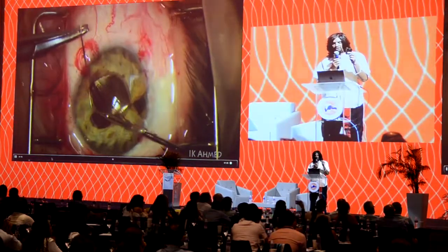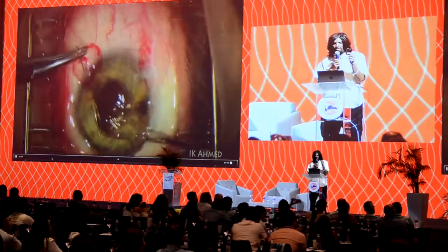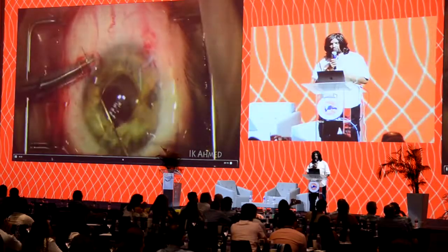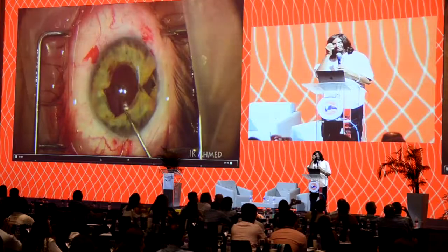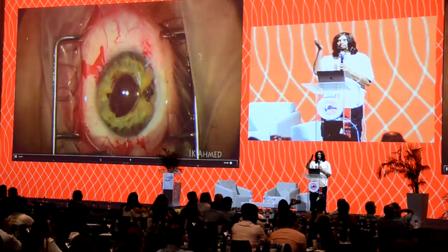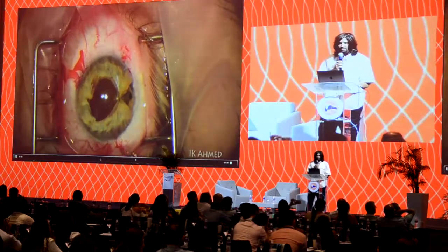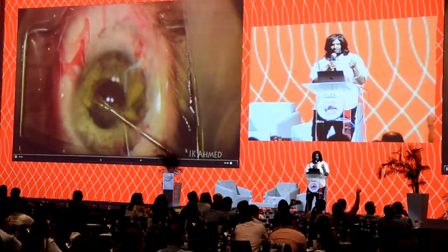Now notice what I'm doing here. I'm taking 3 bites. This is kind of a partial cerclage, so to speak. By taking an extra third bite, it helps to round out the suture. I couldn't do it here up top because of the iridectomy, but it creates a rounder appearance of the pupil by taking that extra bite in the middle. And then we do the same thing, both ends out of the eye, loop the suture, slide it in.